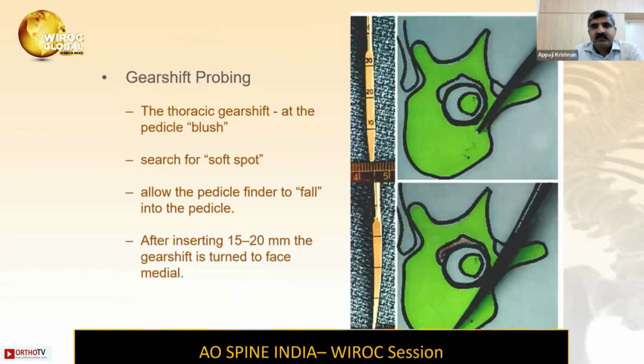So the most commonly used technique is the gear shift technique as described by Lenke. I think it was previously described by Chiari also. Chiari uses a hand drill or a mechanized drill, and then he probes the pedicle. Lenke uses the gear shift technique.